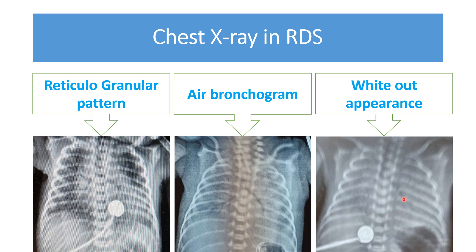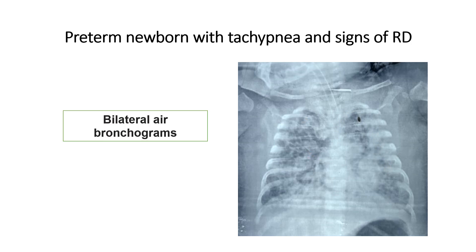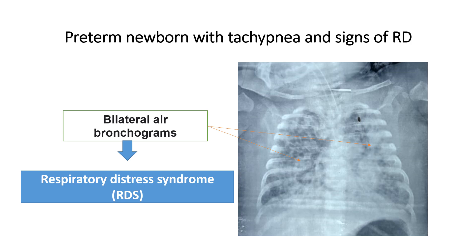Complete white-out appearance on x-ray — where you are not able to differentiate the heart border from the lung — suggests the patient is having severe RDS. Clinically, by the Silverman Anderson score, we differentiate mild, moderate, or severe RDS, and according to the radiological findings also we differentiate mild, moderate, and severe RDS. In this next x-ray of a preterm newborn with signs and symptoms of respiratory distress, bilateral central air bronchogram is present, so we label it as moderate respiratory distress syndrome.